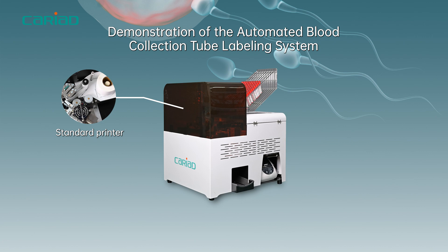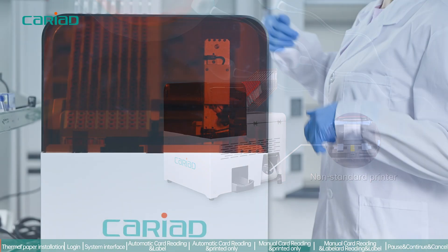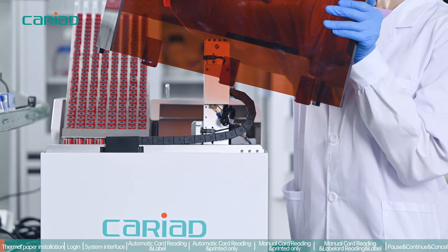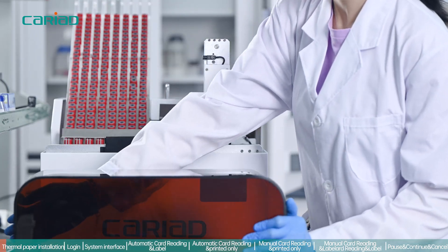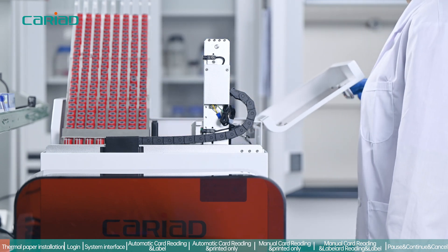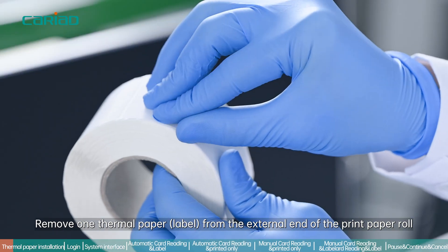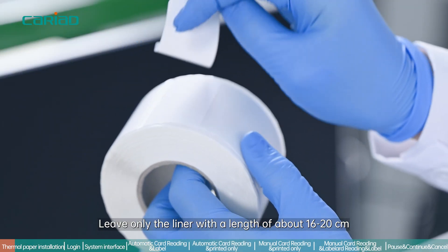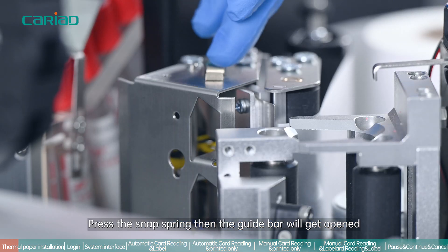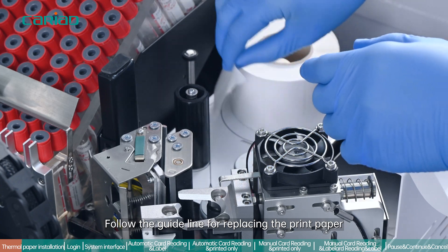Demonstration of the automated blood collection tube labeling system. For standard printer thermal paper installation: remove one thermal paper label from the external end of the print paper roll, leaving only the liner with a length of about 16 to 20 centimeters. Press the snap spring, then the guide bar will open. Follow the guideline for replacing the print paper.